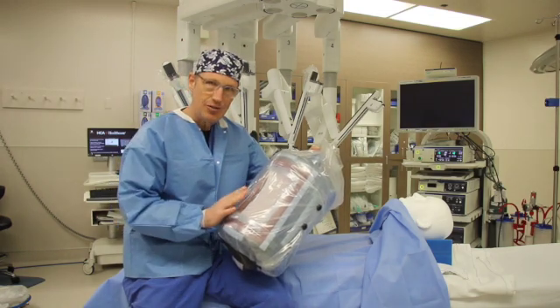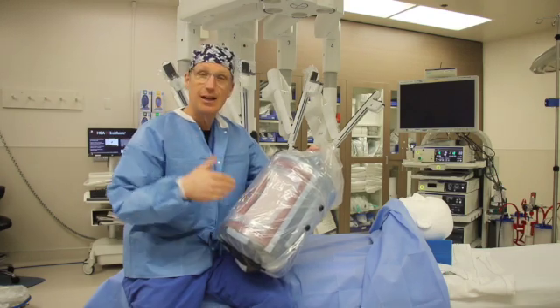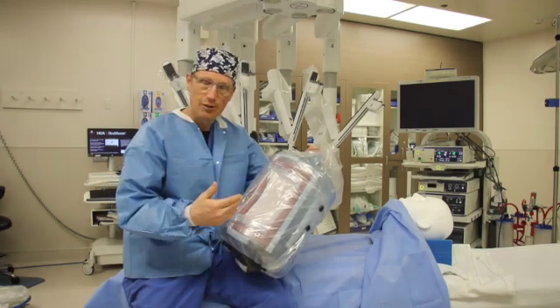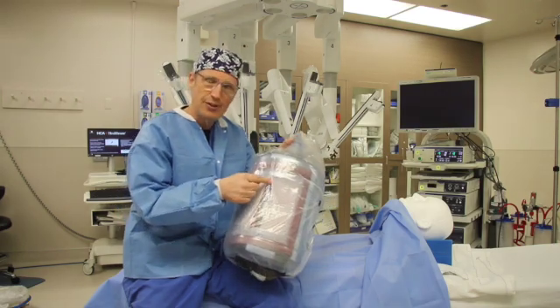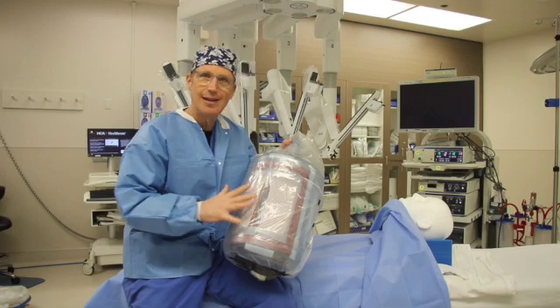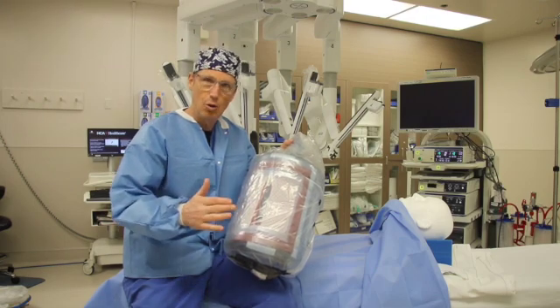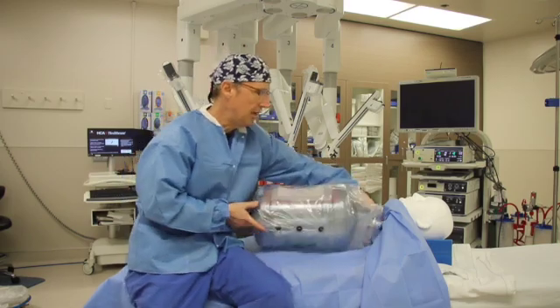The advantage of doing it on the inside is there's not much by way of nerves on the inside in terms of pain for recovery. Also, since I don't have to make such a large incision, something like this can be done as an outpatient procedure — meaning you come in in the morning and go home the same day. So we'll see how this works out.